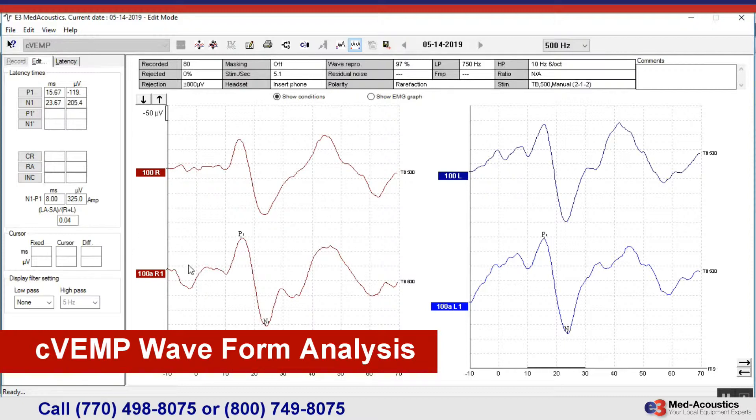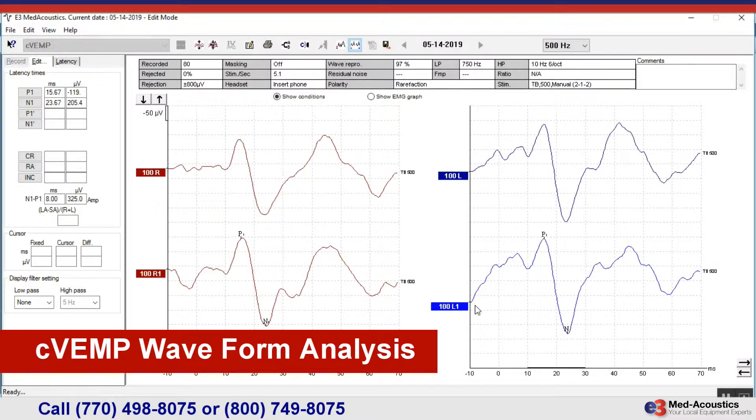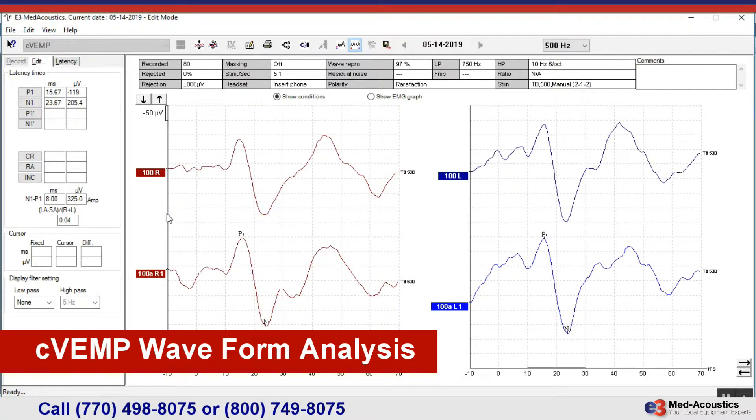If I want to know my asymmetry ratio and have the equipment calculate that so I don't have to do the math, I just make sure they are married. I make one active, go over to the other one I want to marry to it, right-click on the handle and say 'set as VEMP partner,' and it will automatically calculate the asymmetry ratio. In this case it's 0.04. The abnormal threshold is an asymmetry ratio exceeding 0.35, so this is well within the range of normal.